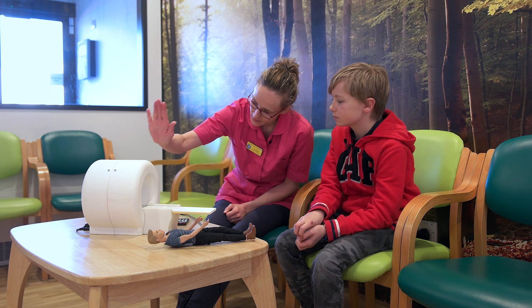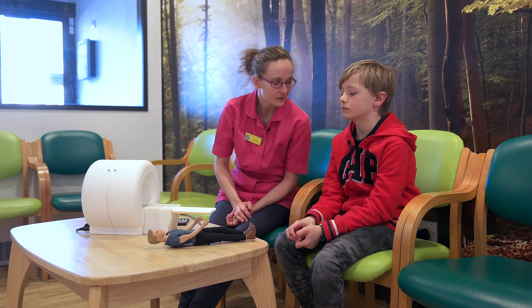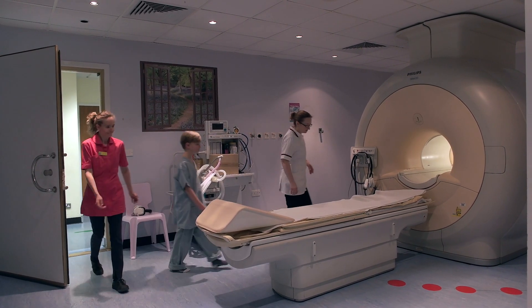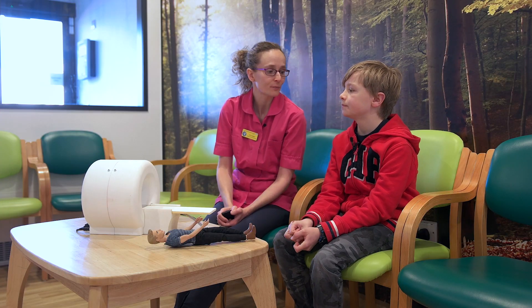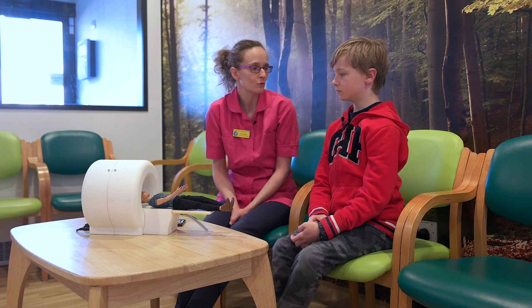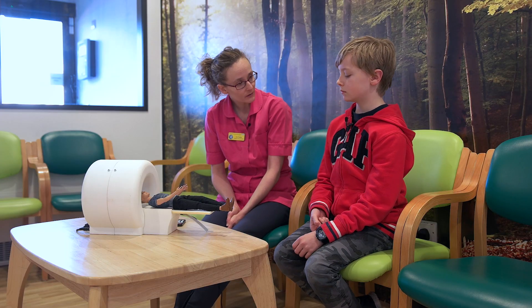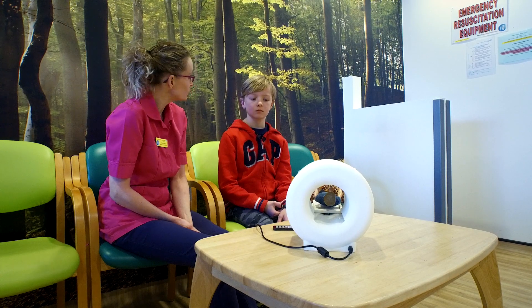I've made a mini MRI scanner here. This is called Mr. Isaac Scan-Do-It. So what happens is the first thing you're going to hear when you walk into the room is a bird chirping sound, and that means that the magnet is switched on. You can put the figure onto the table. What's going to happen is you're going to hear some very, very loud noises, a little bit like being on a building site. The noises are nothing to get scared about, they're just very, very noisy. Nothing hurts you, it's just noise.